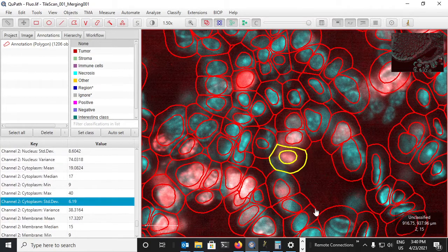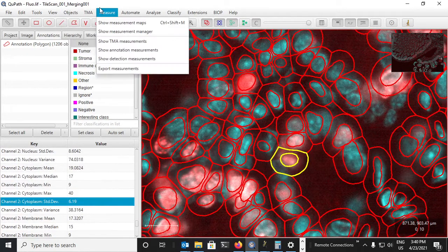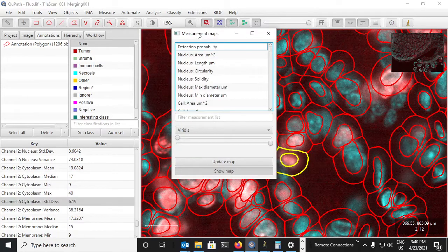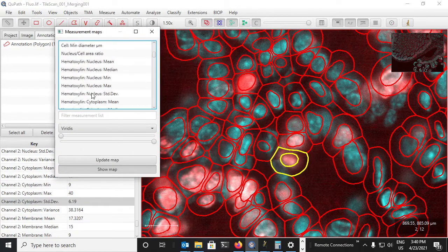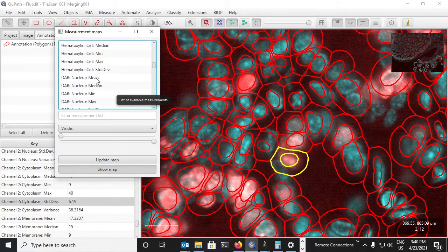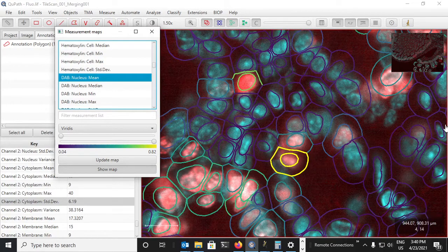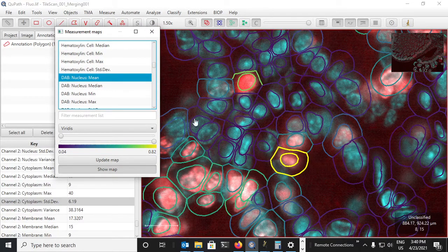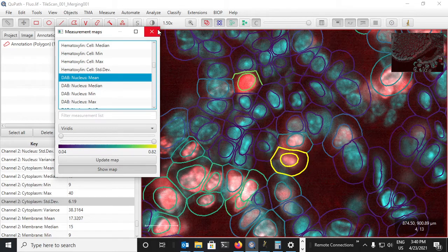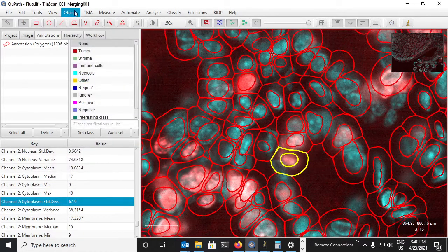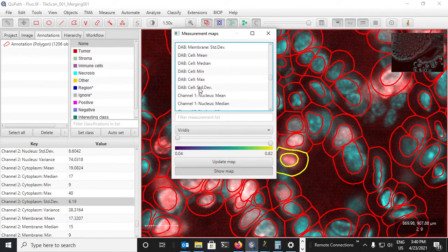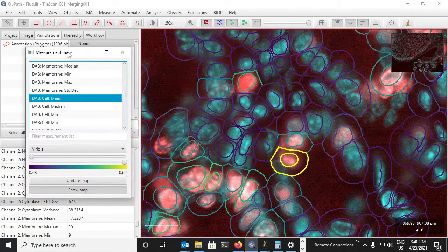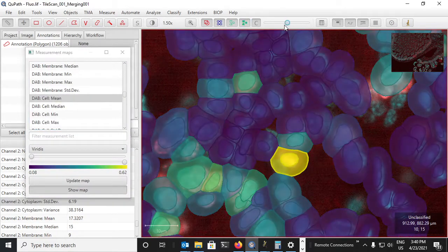We can visualize this by using a measurement map and, for example, trying to visualize what the DAB mean looks like in our images and seeing by eye whether these correlate with the channel two intensities that we see on the fluorescent image. So let's just do that. DAB mean, we can display them like this.